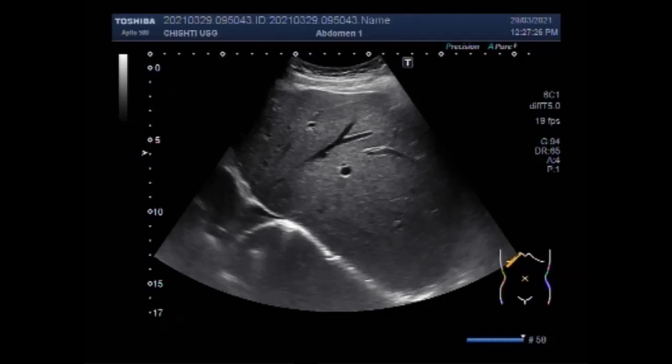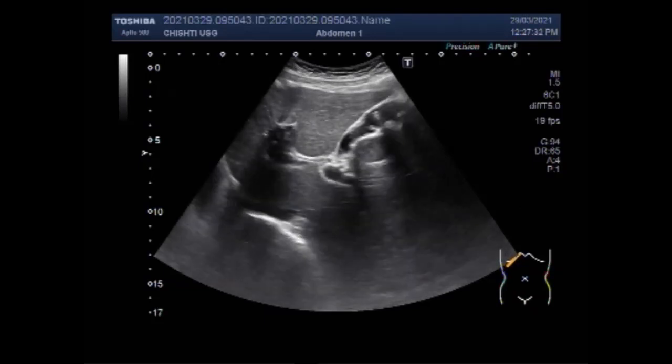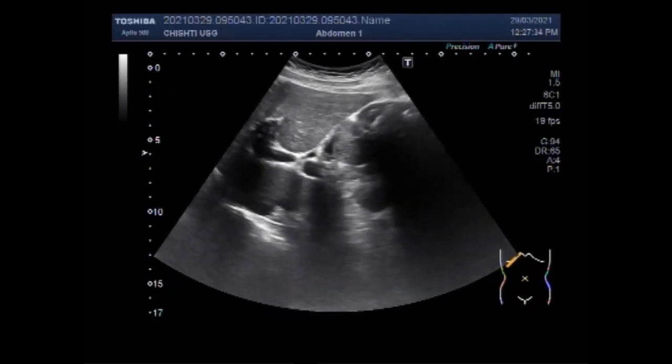You can see the liver and the gallbladder. Multiple stones are seen in the whole length of the gallbladder — cholelithiasis.